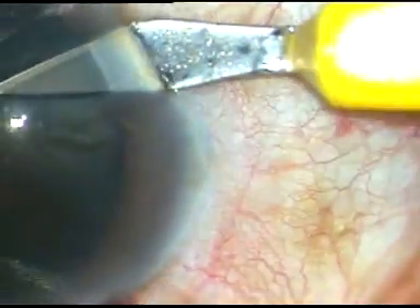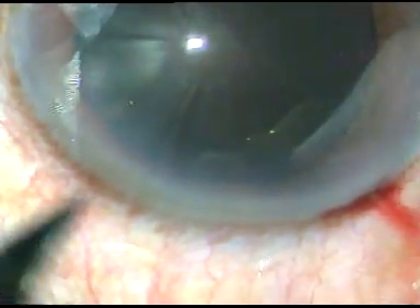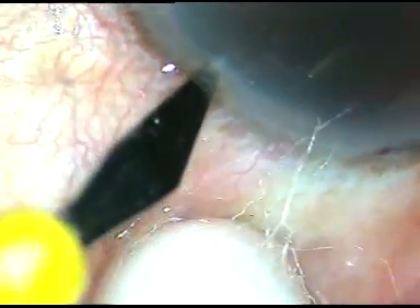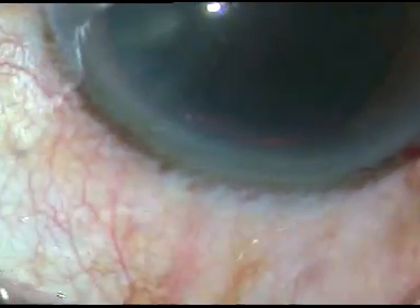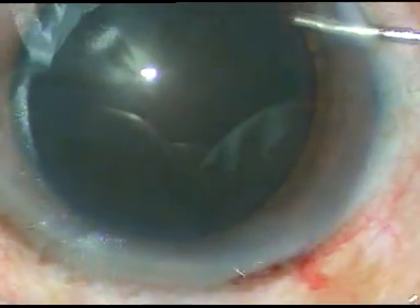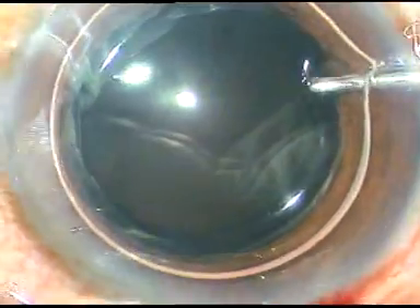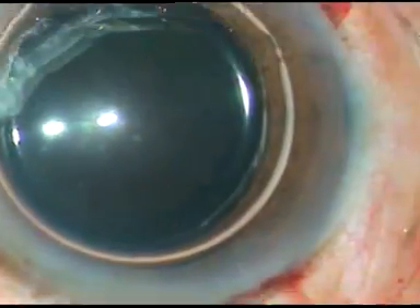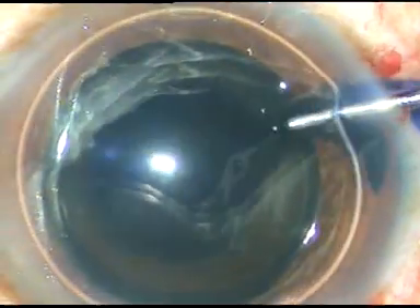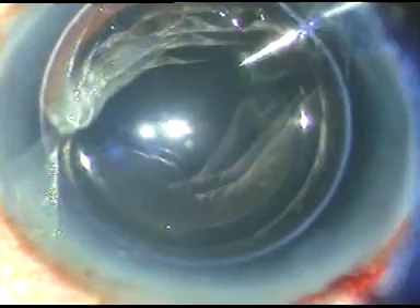The main incision and one side port on the right side of the main incision have been made, and this is another side port on the left side of the main incision. Now, I want to stain the anterior capsule with trypan blue dye, and I always do that underneath an air bubble. This is the trypan blue dye. I am using the dye to get some contrast during capsulorrhexis.